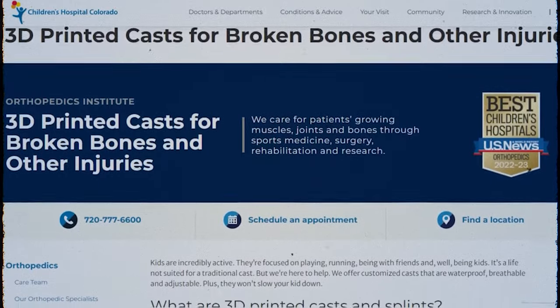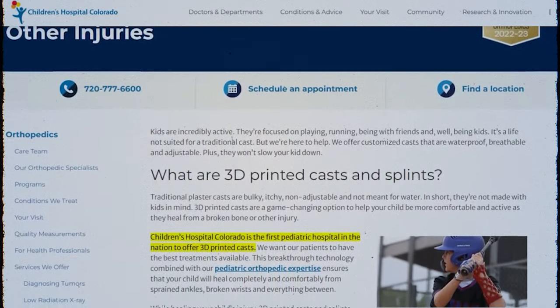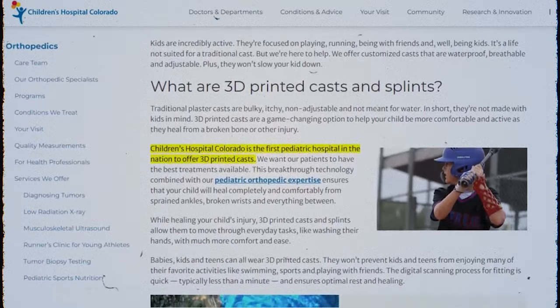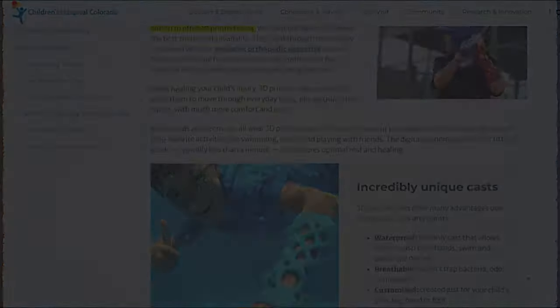For example, Children's Hospital in Colorado announced that it was the first pediatric hospital in the US to offer 3D printed orthoses for children. The technology improves treatment results and removes a number of limitations of traditional methods of treatment.